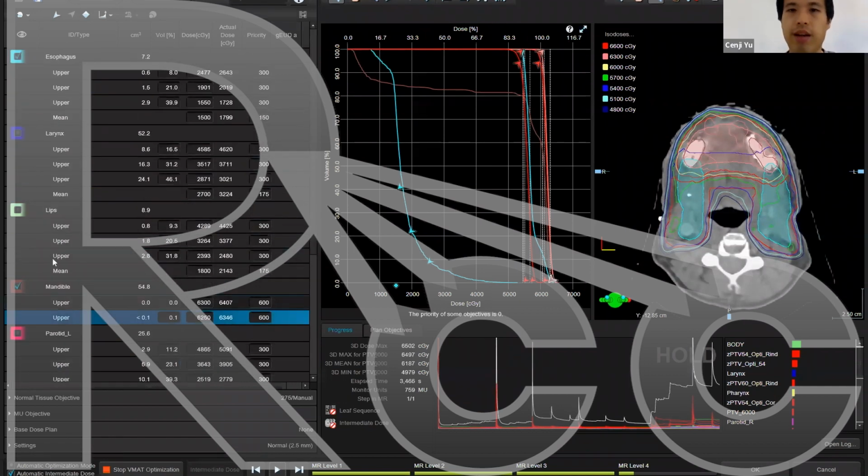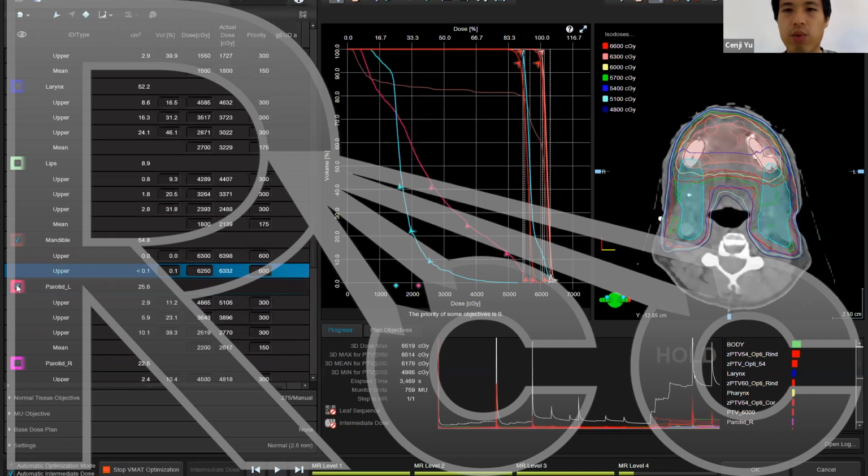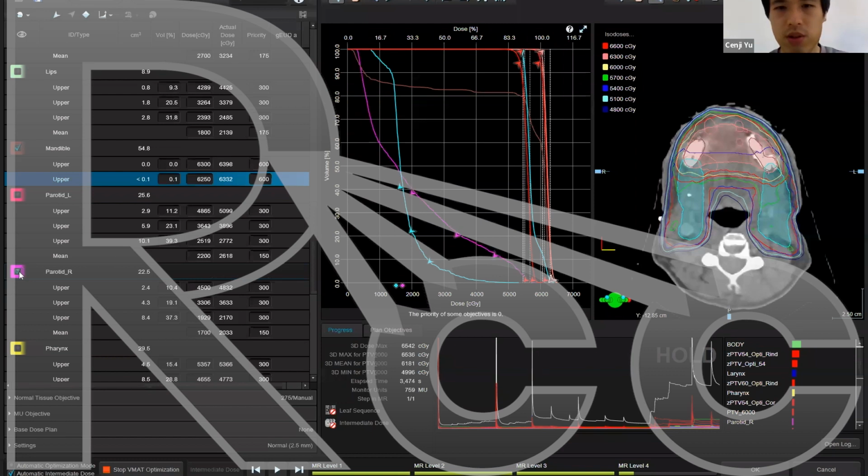Question. Since you mentioned AI, what would you think about RapidPlan versus what we are doing right now in terms of clinical? Yeah. So I've dealt with a lot of institutions that use RapidPlan. I think it's a great tool. It's still based on a large number of good plans with a wide range of PTVs and PTV overlaps. We're planning based completely on dose fall-off expectations and math. And so if you use math and dose fall-off, you're going to get a better plan. So I always get significantly better plans than people that use AI.